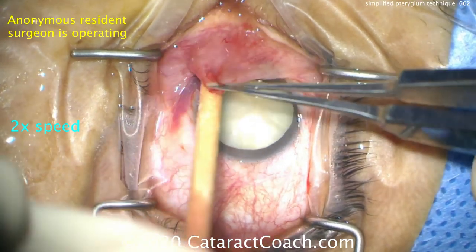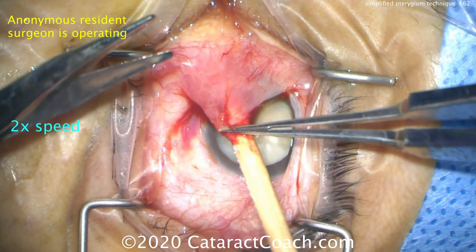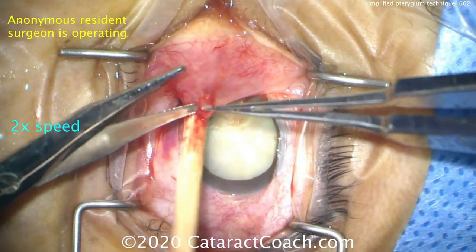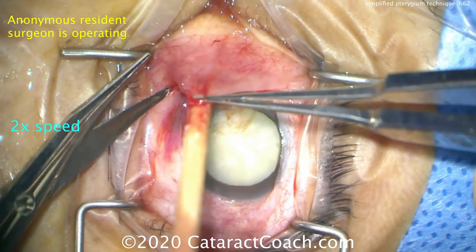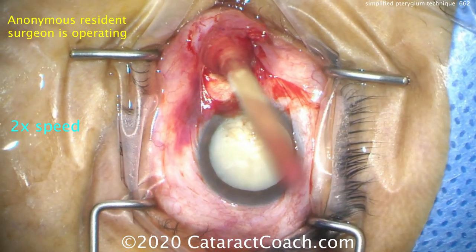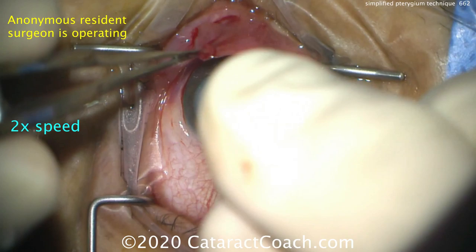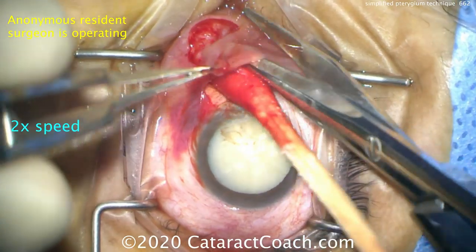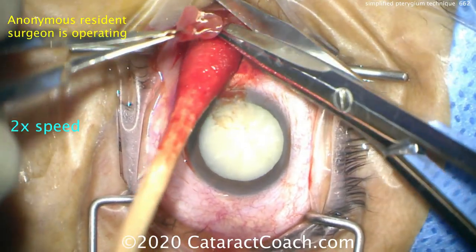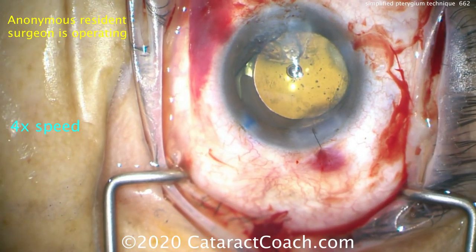Now that cotton tip is forming a barrier — it will protect the medial rectus as we cut off the pterygium. That's a smart technique. So putting it on traction with forceps; there's only one surgeon here operating, just the resident. That's important — you need to be able to do this procedure all on your own. You can't rely on having an assistant, because that's a luxury we don't have in the real world. That Q-tip's protecting the medial rectus as we cut off the pterygium. You can dissect back as much as you want — try to get the base of it and make it as clean as possible.